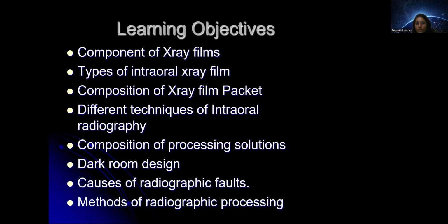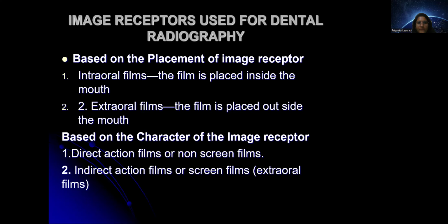At the end of this topic, you will be able to answer the components of the X-ray films, types of the intraoral X-ray films, composition of the X-ray film packet, different techniques of intraoral radiography, composition of the processing solution, darkroom design, causes of radiographic faults, and the methods of radiographic processing.